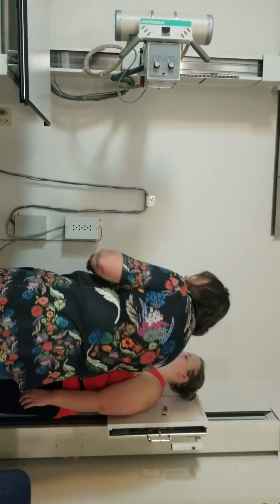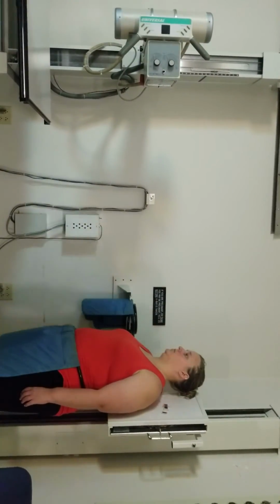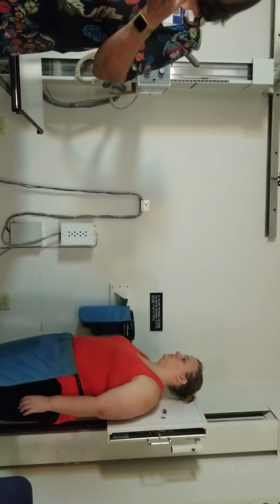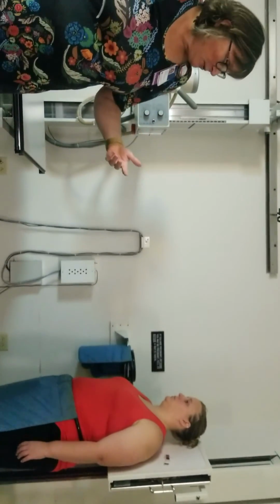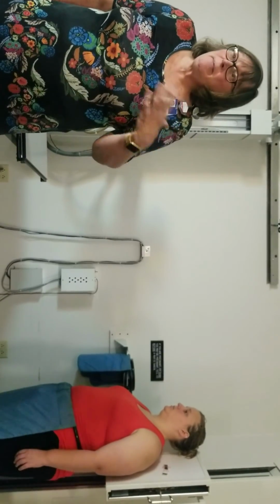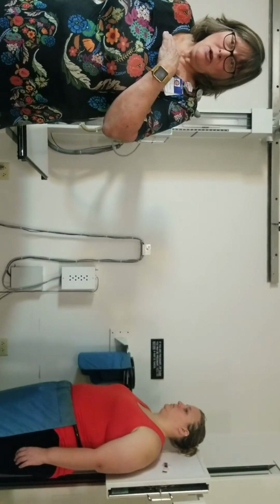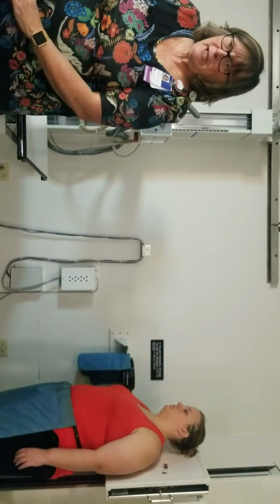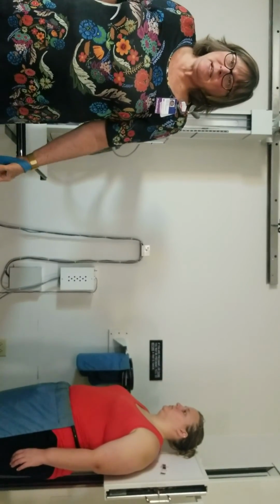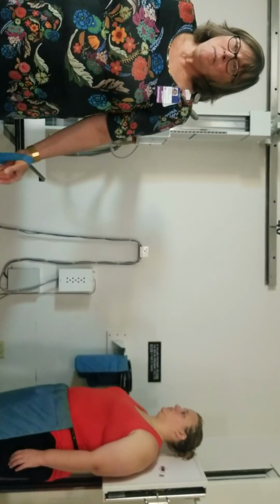And one of the things I'm going to want to do before I give the patient some weights is to make sure there is not a fractured clavicle or shoulder. Does that make sense? Usually when I've done AC joints, I've already done their shoulder, I've done their clavicle, and they've been negative. But if they just come in for AC joints, you want to do the non-weight bearing first. Take a look to make sure there's no obvious fractures before you give them these weights, okay? I'm going to ask my patient to just put them around their wrist like this and let the weights pull down on their joints, okay?